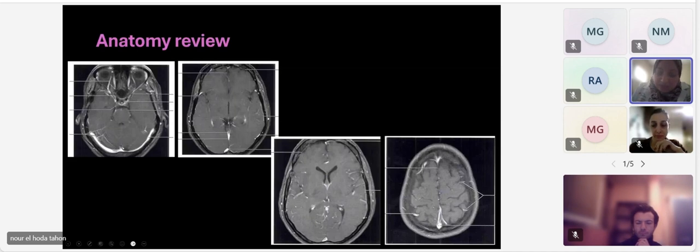since it's not thick and not nodular, because sometimes a patient has leptomeningeal disease, for example. I would start to worry if the patient had thickening around the meninges and it's nodular, which has multiple possibilities. It could be infection, like sarcoidosis or TB, or it can be tumor, right?